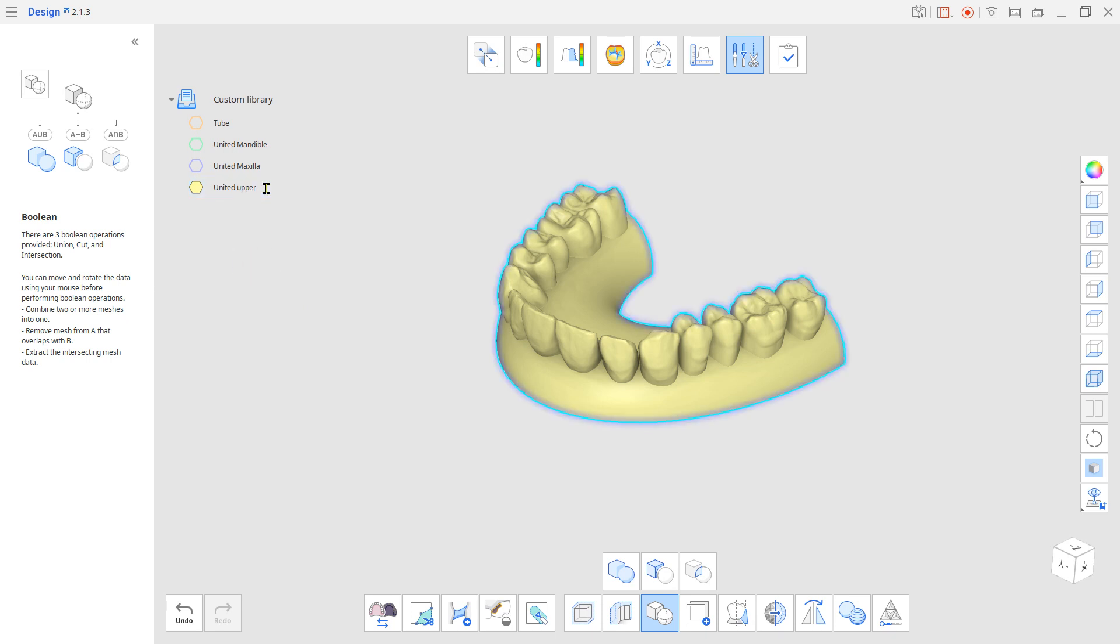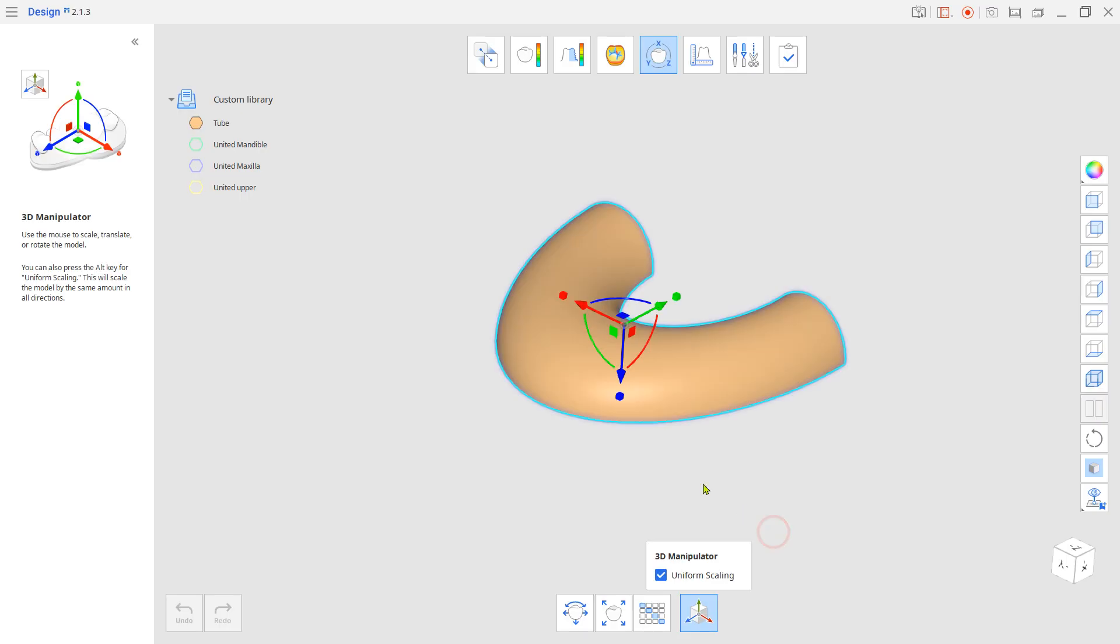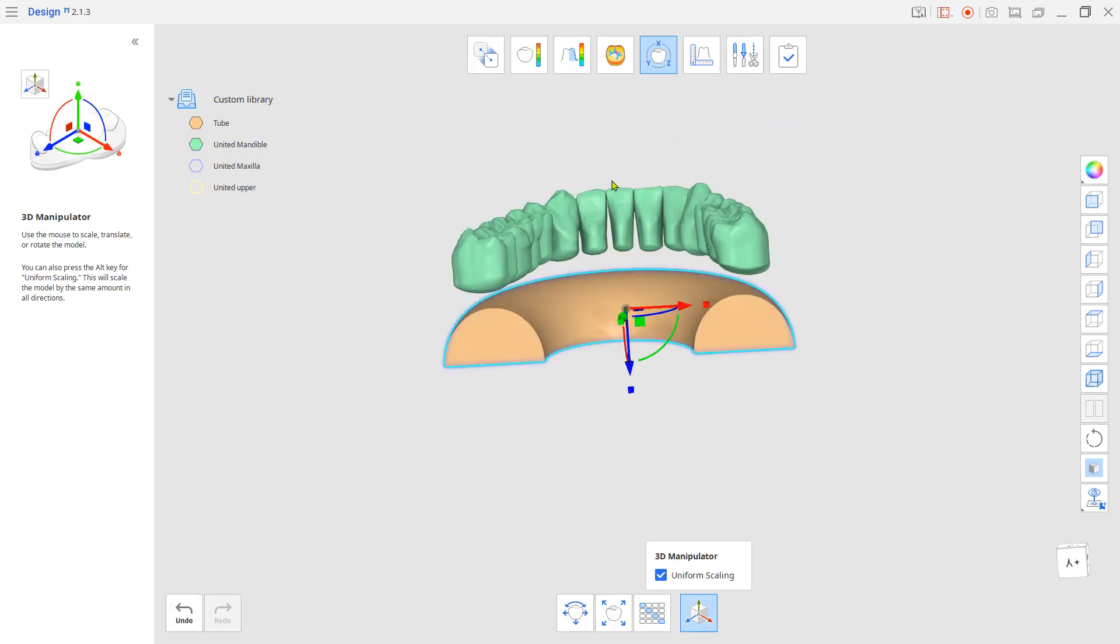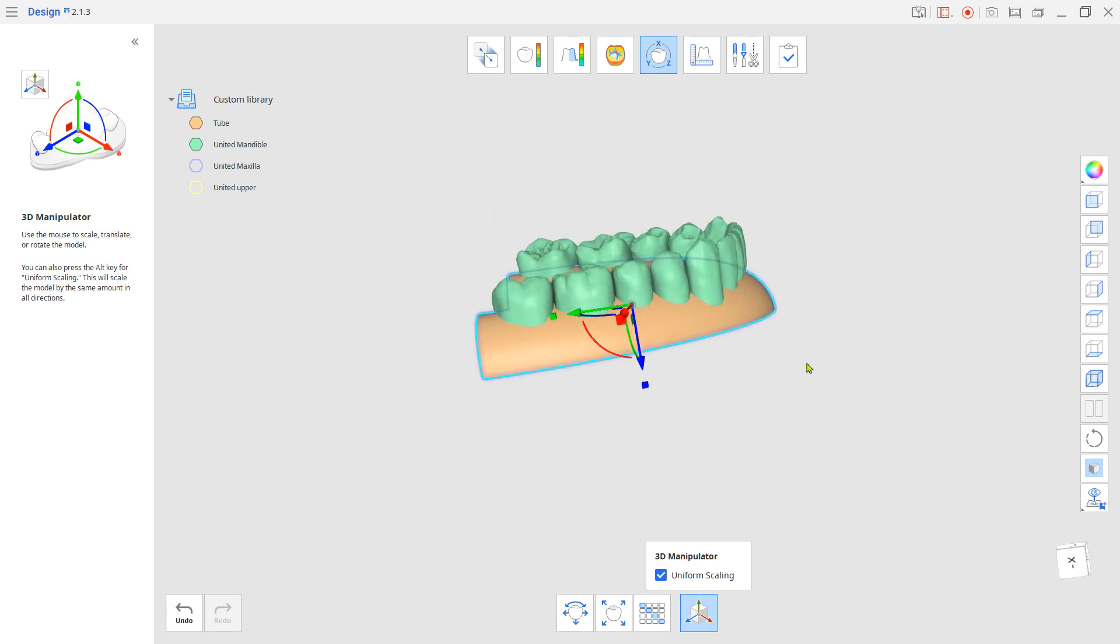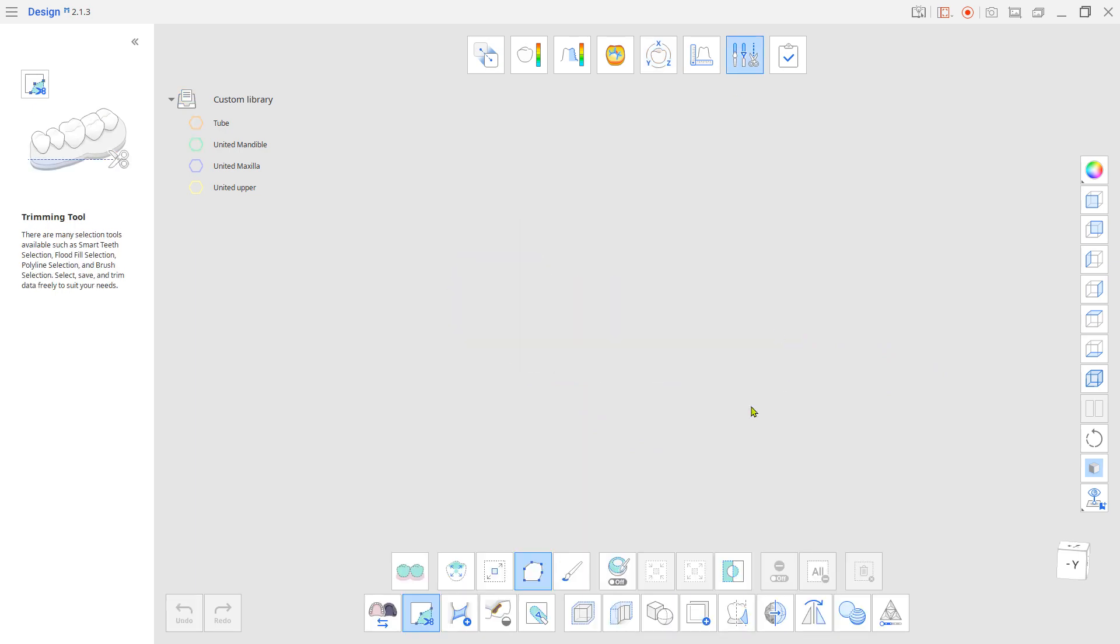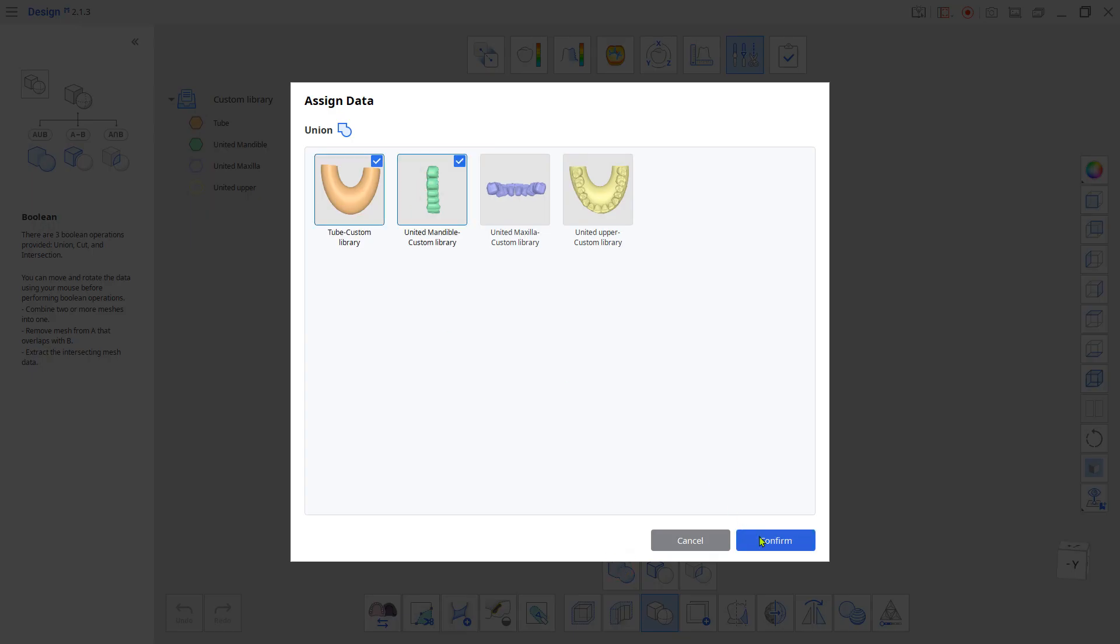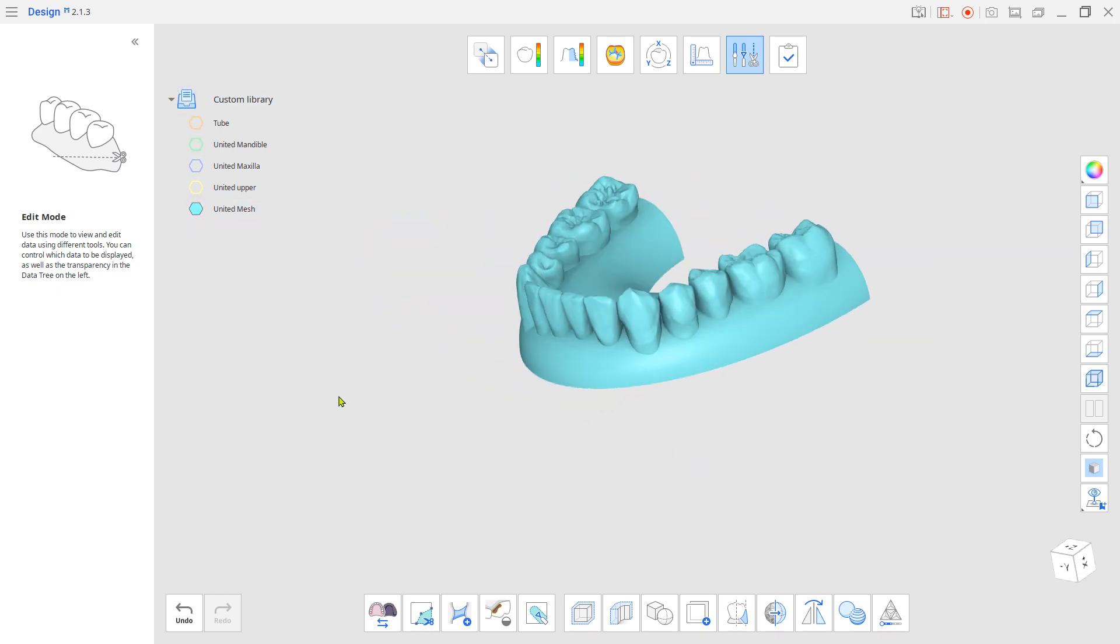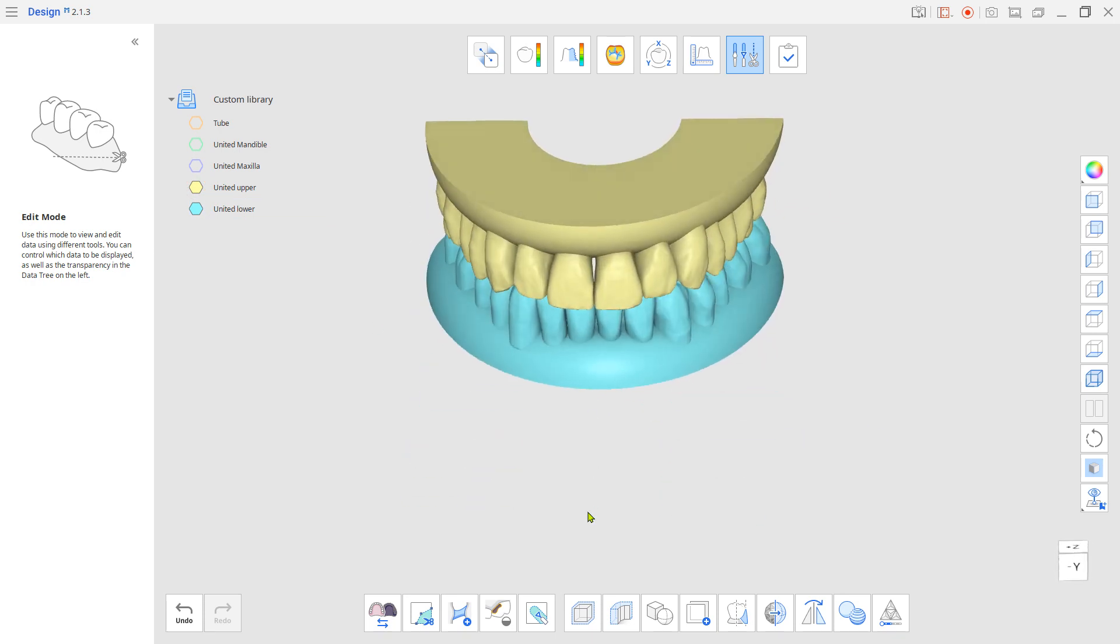Use the same process for the mandible. Change the name to distinguish the new data from the previous one and click complete to save.